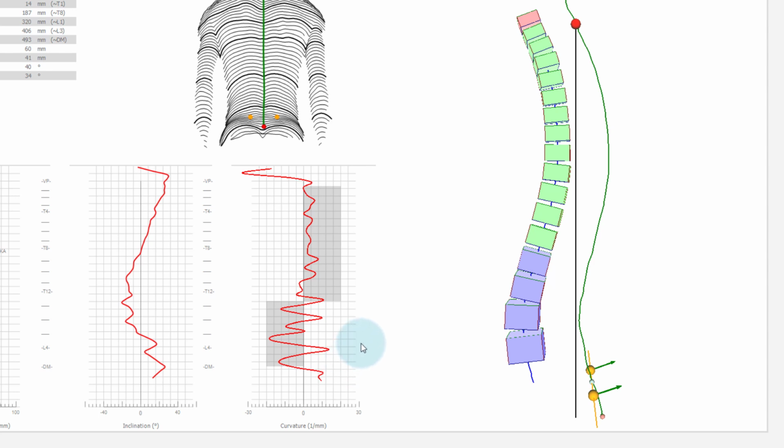The curvature on the right side shows, clinically speaking, the shift of each segment in an anterior or posterior direction. Since all levels are in relation to each other, the noise of a larger section is expected to remain at a constant level. To make the description a little more figurative, place your index finger on the spinous process of C7 and travel down the spinous process line from there. Over a spinous process, your finger travels over an elevation, between two spinous processes into a depression. Along this path, the finger travels in a steady back and forth motion.